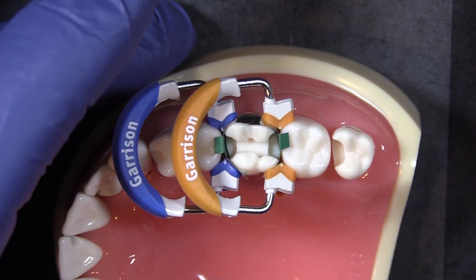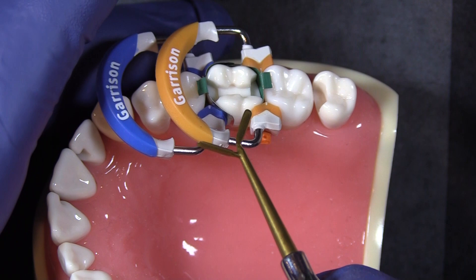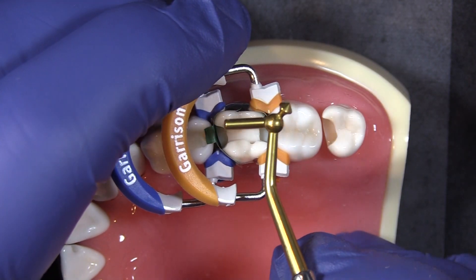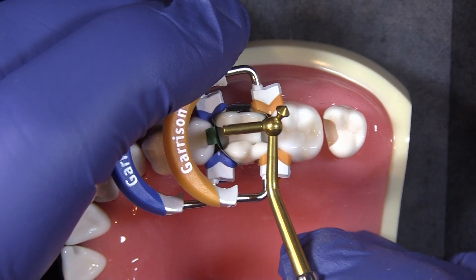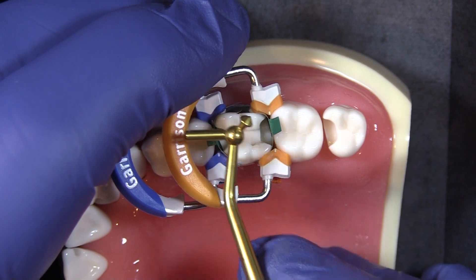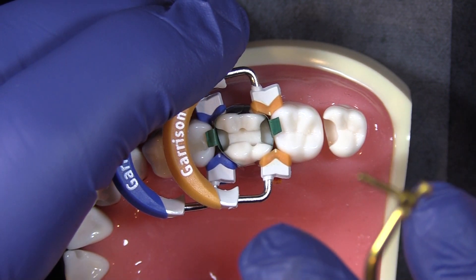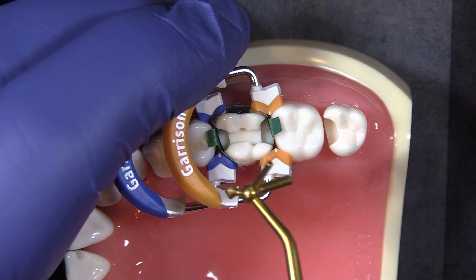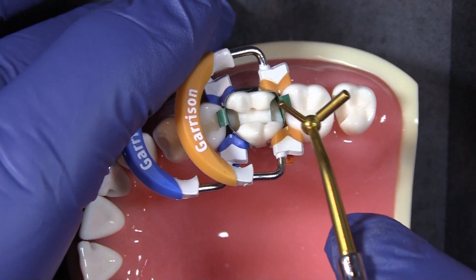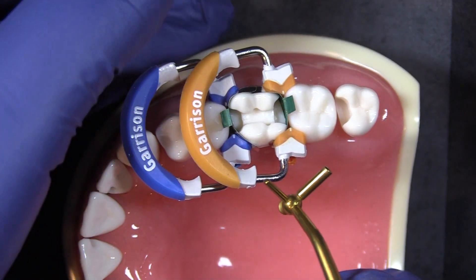So there's less likelihood of recurrent caries. With the bands not being attached all the way around the tooth, I can easily manipulate the band into exactly the position I want. It doesn't want to spring back, I don't have to loosen anything, and look at this — I have a wonderful seal on my buccal and lingual margins to prevent flash.